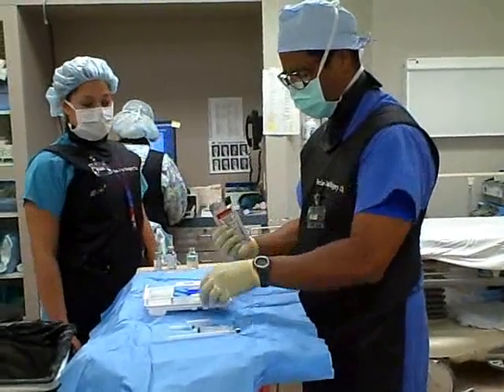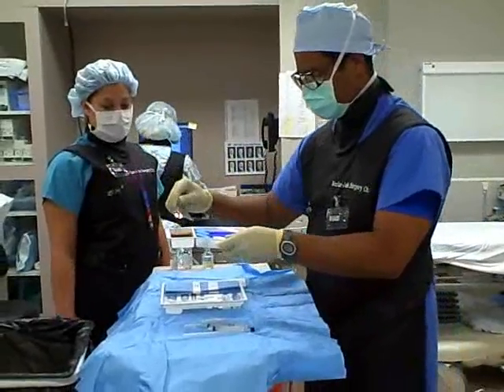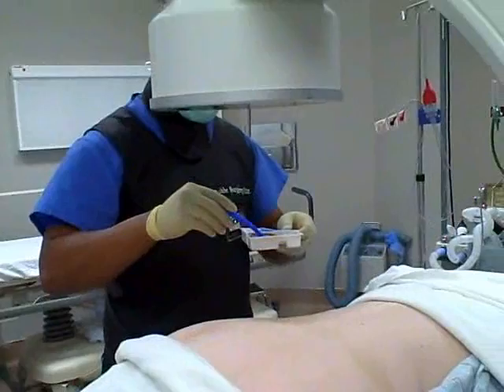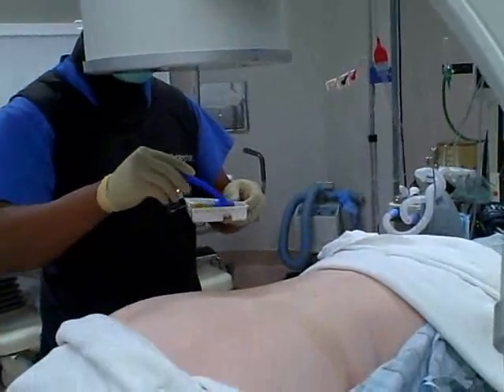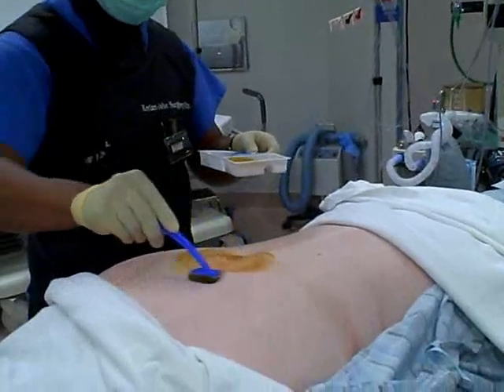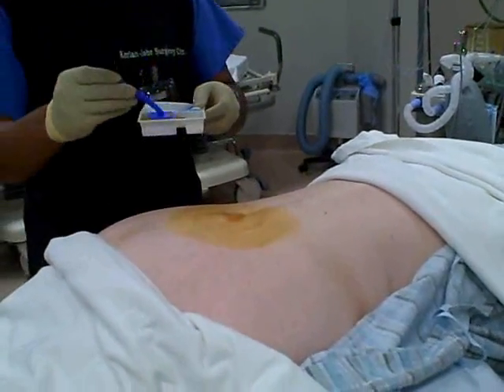The lumbar epidural steroid injection is a very straightforward procedure, one that we can usually complete in 10 minutes or less. We start by escorting the patient to the procedure room, where we'll lie them on their stomach and clean their back with sterile cleaning solution. We usually place a small pillow under the waist.